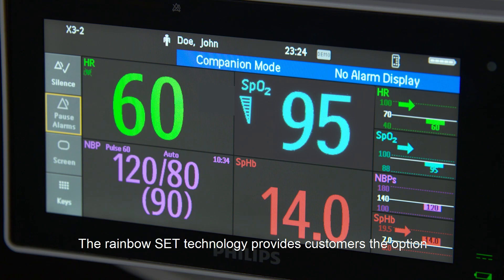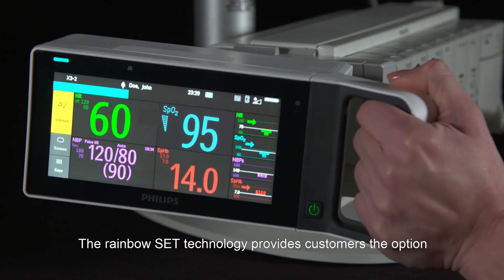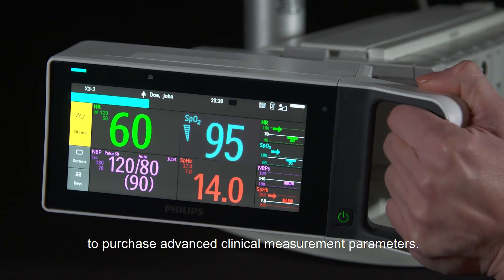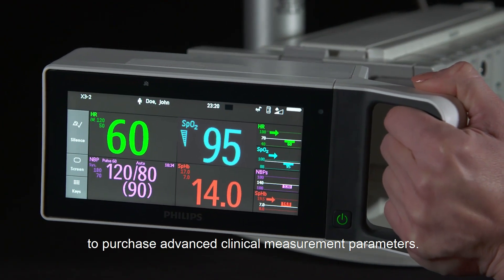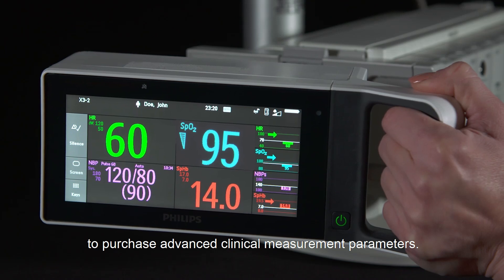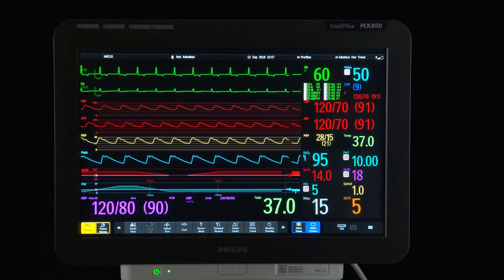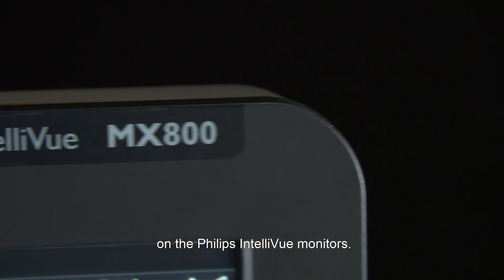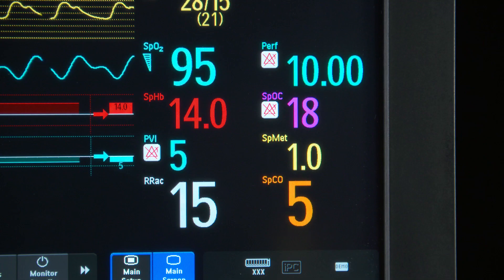The Rainbow Set technology provides customers the option to purchase advanced clinical measurement parameters. Let's now review the Rainbow Set parameters on the Philips Intelliview monitors.